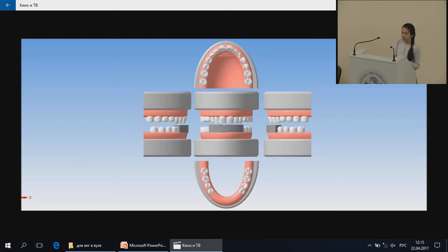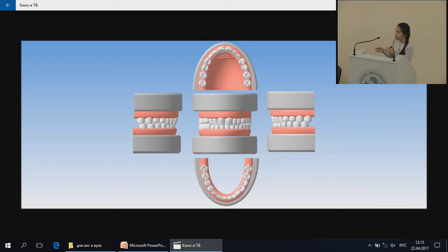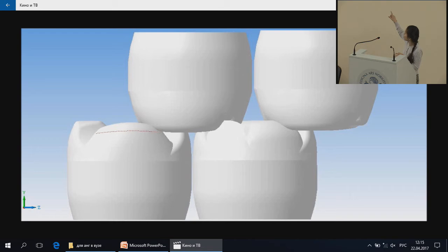After that, we put the frontal group of the teeth, and we start with the central incisor and the lateral incisors. We put them in parallel, so the cutting edge of the central incisor should be slightly below the lateral one. About the canine's cusp, it's interesting because it should be tilted a little to the midline, because the medial part of the buccal surface will be the continuation of the frontal oval that is formed with the frontal group, and the distal part of these teeth will be the beginning of the lateral group. Here you see the fissure-tubercular contacts.